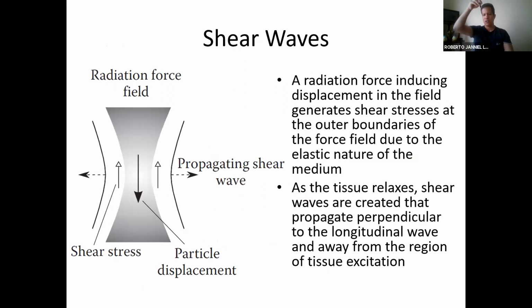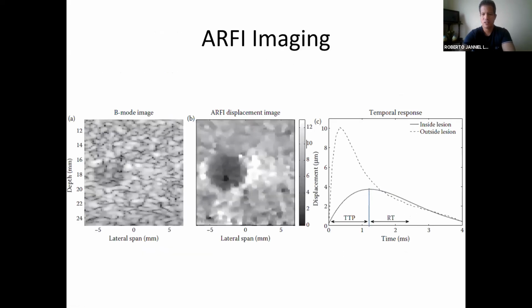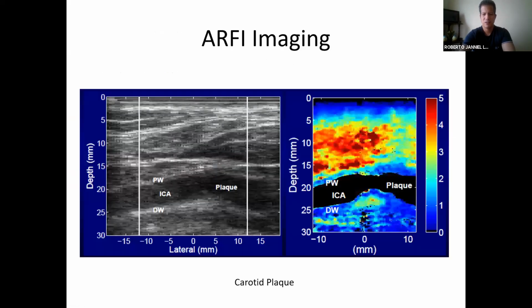You generate a radiation force pulse in the vertical direction, and that's going to generate a shear wave traveling to the sides. And if you keep tracking with ultrasound operating in just conventional pulse echo mode, then you get to create elastographic images that, and I'm going to skip ahead a lot, would look something like this.